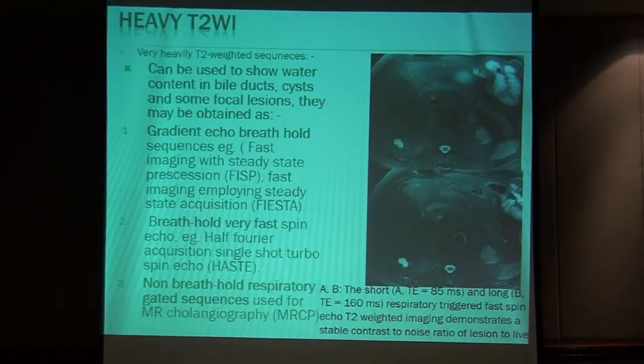They may be obtained by, they have all the same idea of long TE: gradient echo breath hold very fast, and non-breath hold respiratory, MR cholangiography.